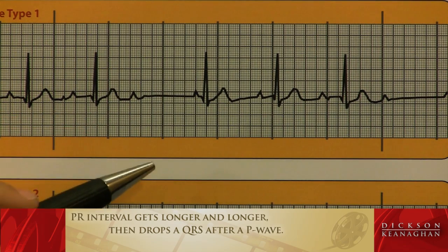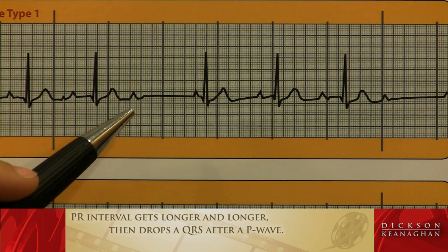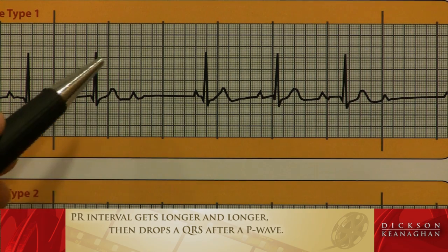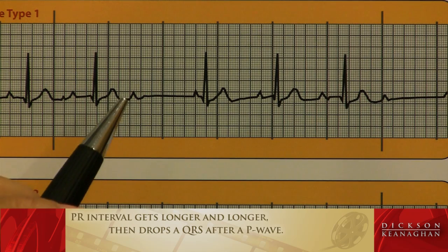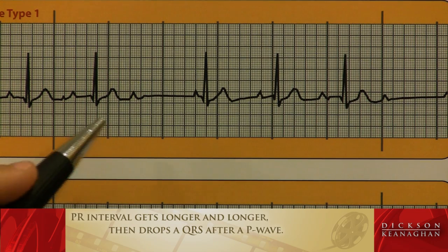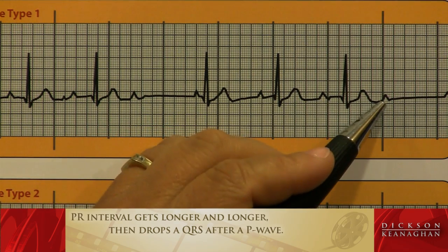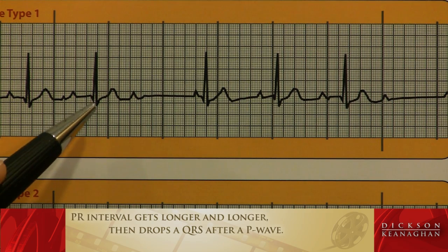We still want to count our atrial rate and ventricular rate. In the first degree heart block, the atrial and ventricular rate were the same. In the remaining three heart blocks, there will be more P's than Q's — that's helpful in identifying a heart block. Counting the ventricular rate in the six-second strip: one, two, three, four — the ventricular rate is 40, which is certainly a bradycardia. The atrial rate: one, two, three, four, five — the atrial rate is 50. So there are more P's than Q's. Ventricular rate 40, atrial rate 50 — I know it's a heart block.